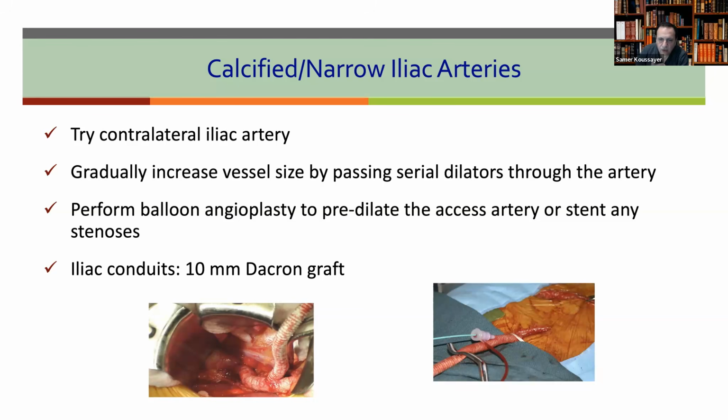Because if you stent it now, when you put a device at the stent, it may move with the device. So my advice: balloon now, even if you see dissection, no perforation, of course. See dissection, don't worry about it. Keep going with your EVAR. After you finish, on your way back, you put a stent for the dissection.